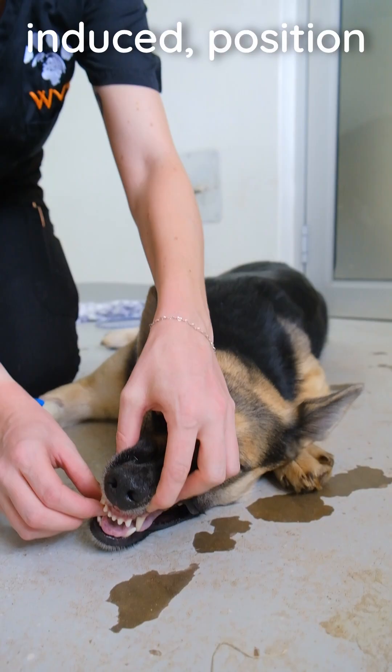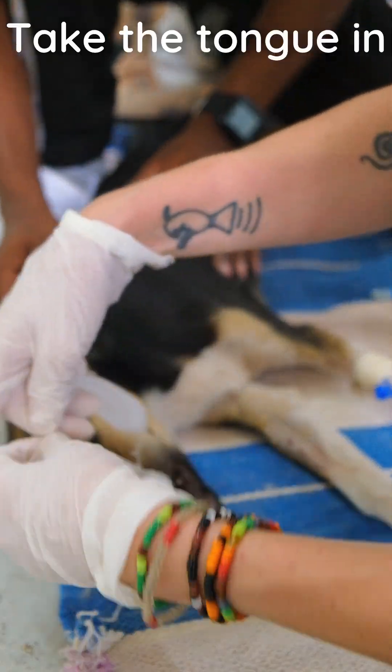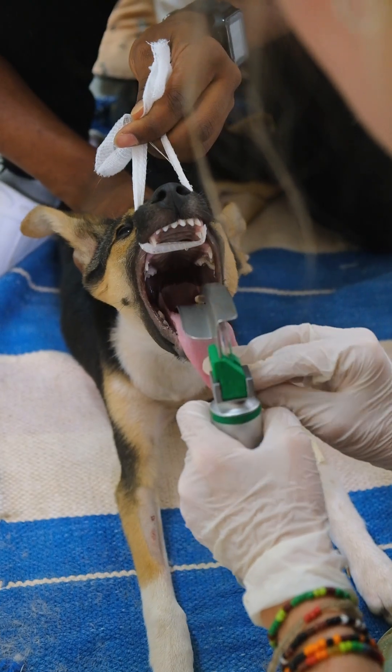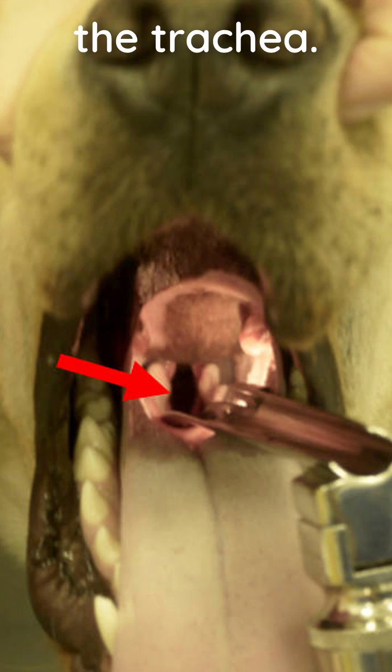With the patient induced, position in sternal recumbency. Take the tongue in your non-dominant hand and place the laryngoscope at the base of the tongue. Gently press down to lower the epiglottis and visualize the trachea.